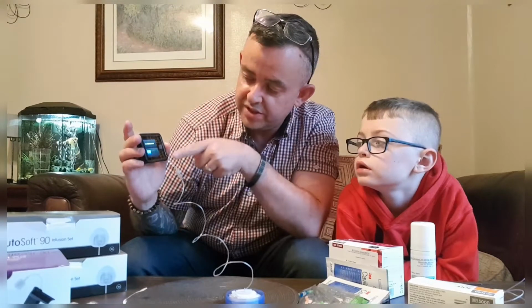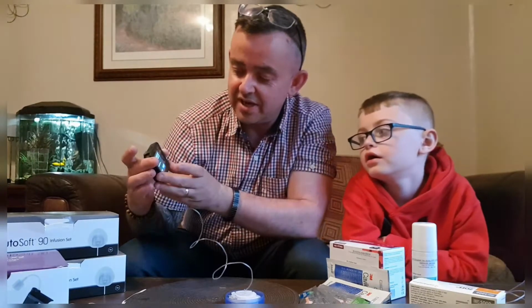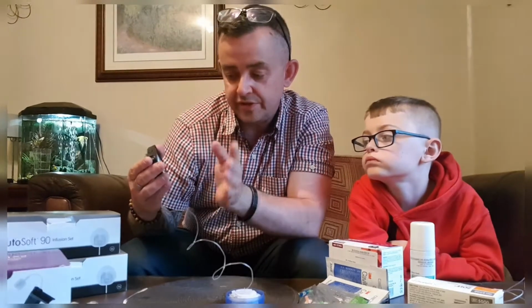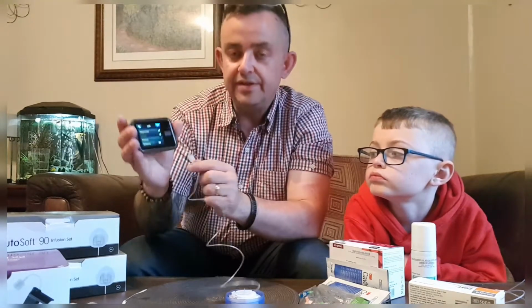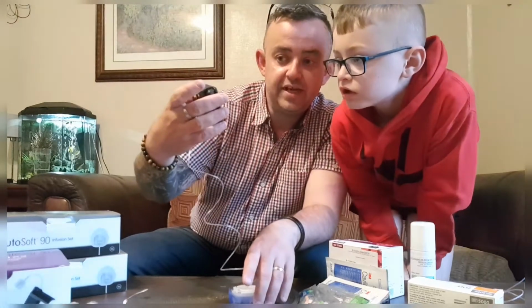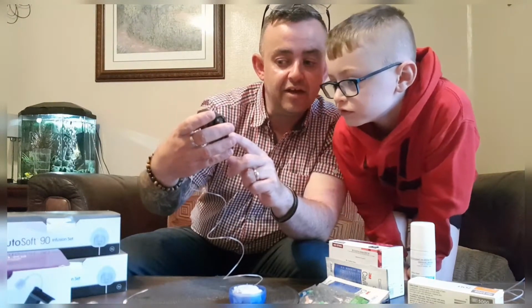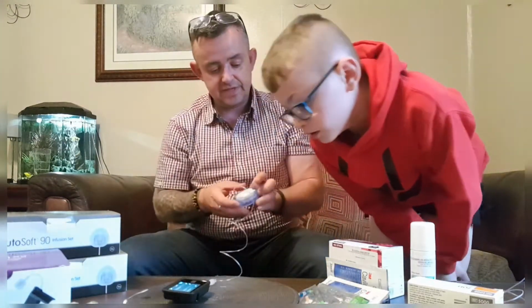Can you see it? What percentage are we on? That's 100%. If you see drops at the end of your tubing, press done. So, the next stage, you can see there: change the cartridge, tick. Fill tubing, tick. Fill cannula. So that's the stage we're at now. And a site reminder.